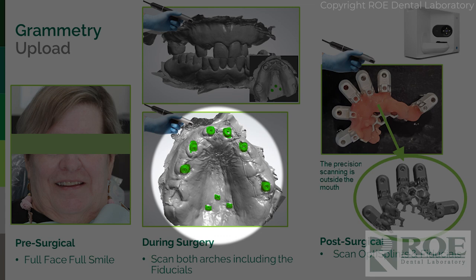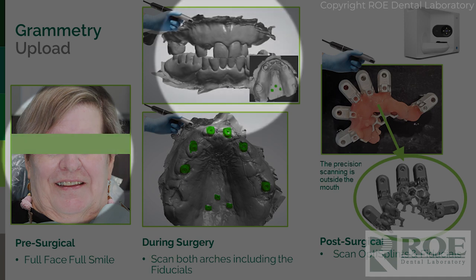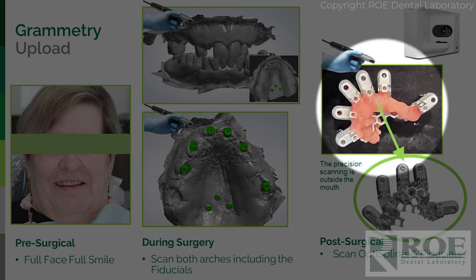with the healing collars. All right, so let's do a real quick recap. Photographs, day of or before. Setup, before if you wish. Or, as you can see here, this case here, this is all day of surgery records. Scan the patient before with the screws, okay? Scan the patient after with the healing collars and the screws again to match. Scan the OptiSplint outside the mouth. That is how this case is completed.